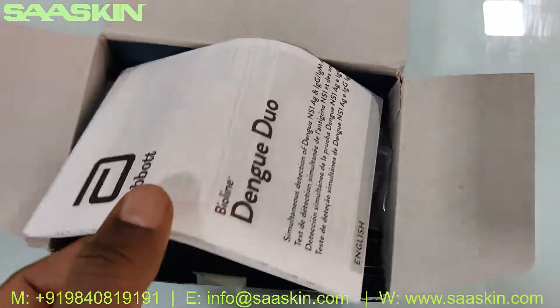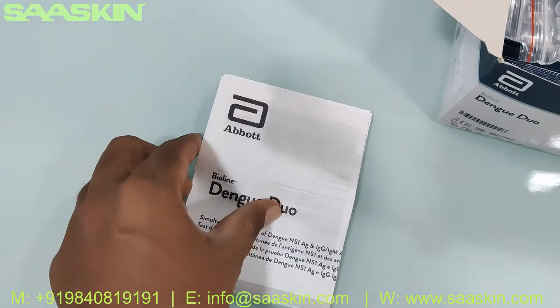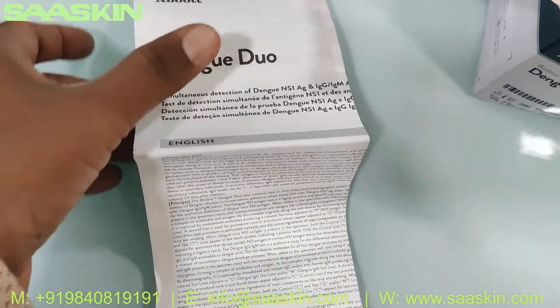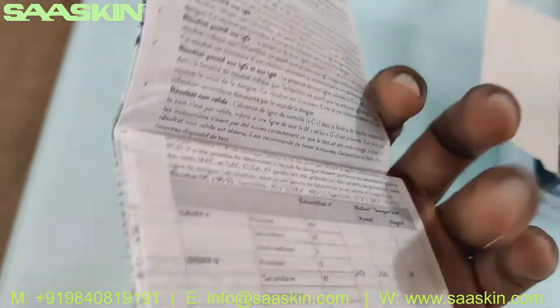Inside the box you can see there's a complete IFU brochure manual. The complete IFU brochure manual is given, which provides complete instructions and details in different languages.